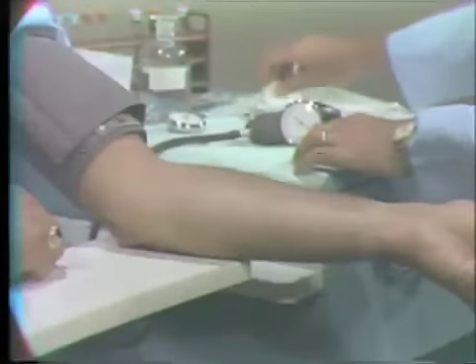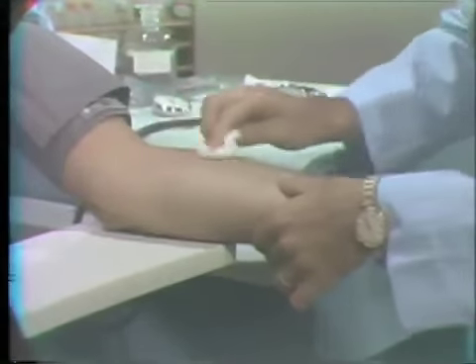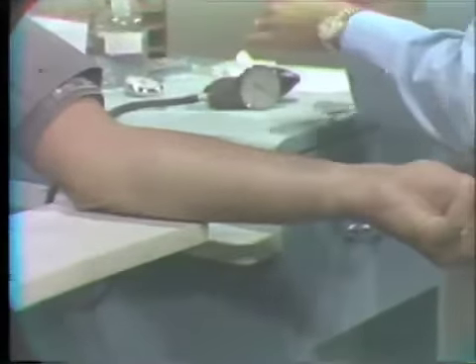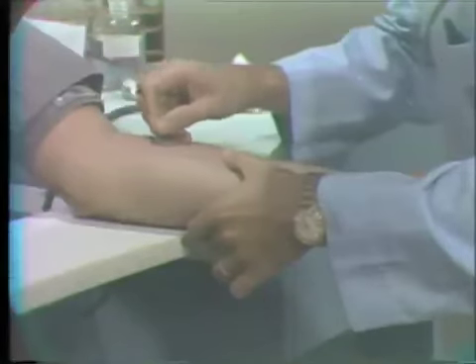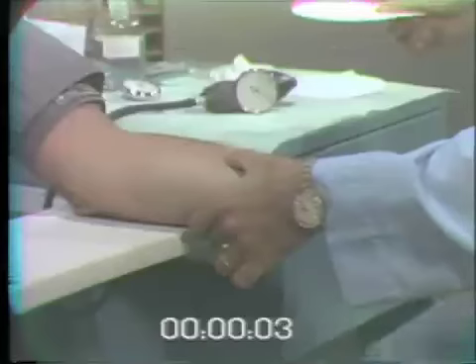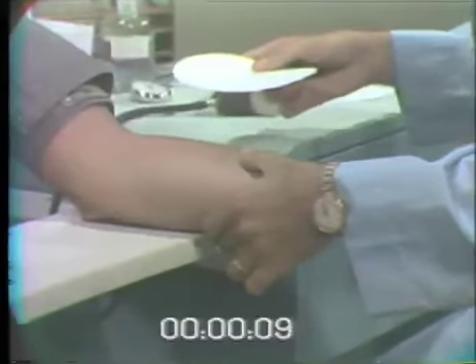We will then cleanse the area that we have selected with alcohol, and again drying the alcohol off. Again, being careful we don't press too hard to not set up a wheal and flare or any reaction which would cause bleeding. We'd make 3 distinct punctures, 1, 2, 3, and start our stopwatch. The blood will well up, and you'll notice that 2 of the punctures are bleeding well and the other isn't.